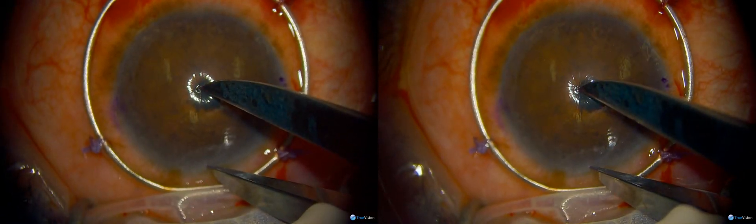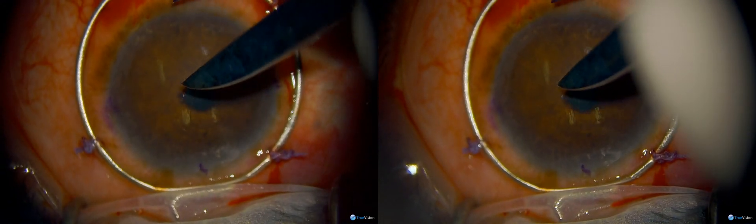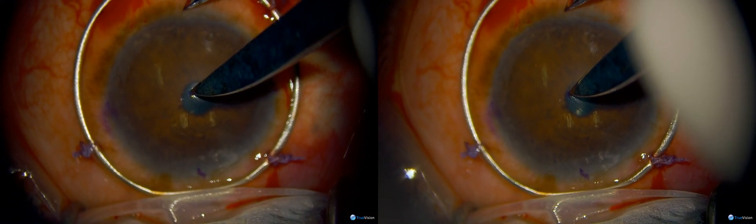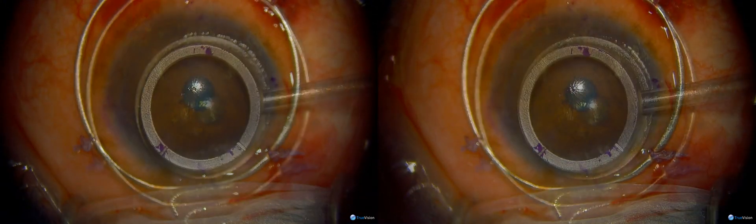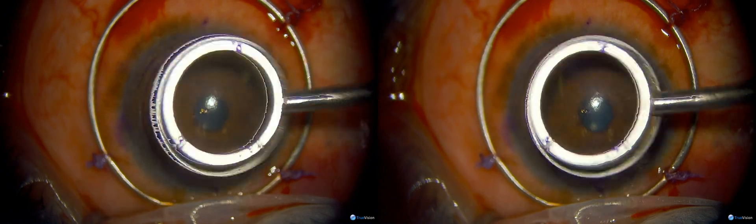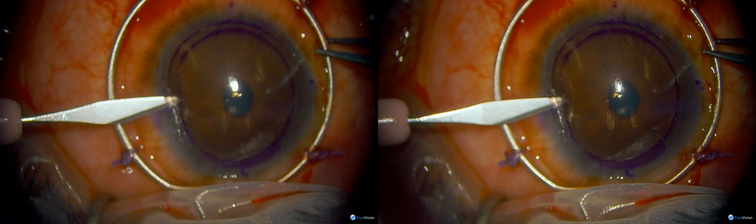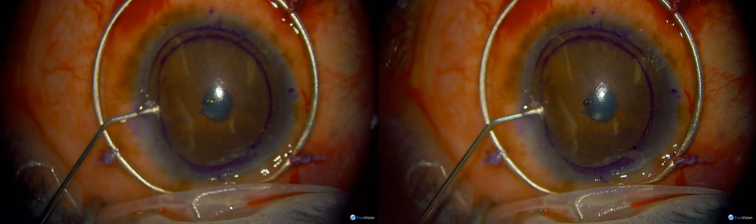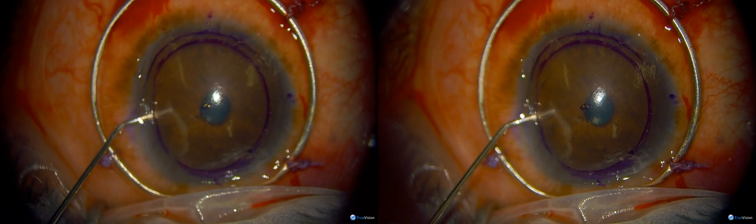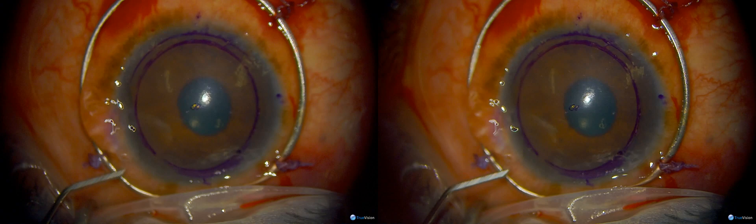Here she's marking the geometric center of the cornea from the limbus, which you pre-measure after measuring the corneal diameter. This is an optical zone marker used to aid in trepanation, then that's a paracentesis, and now some injection of viscoelastic into the anterior chamber. This would firm up the eye and help with trepanation.